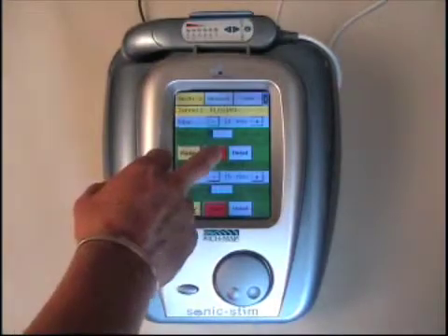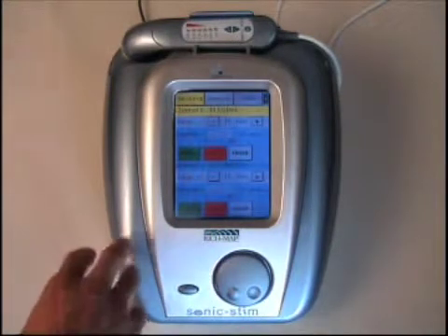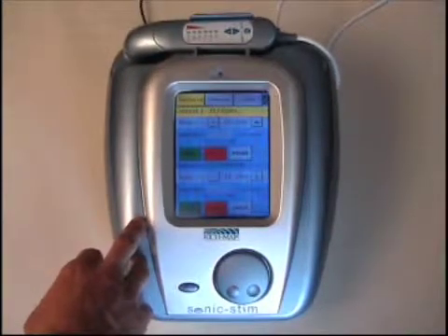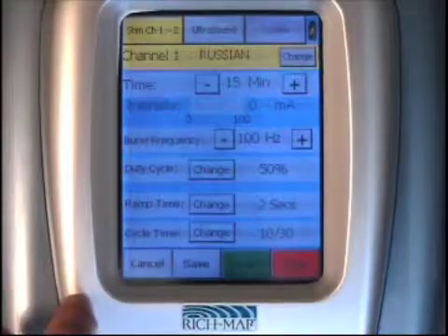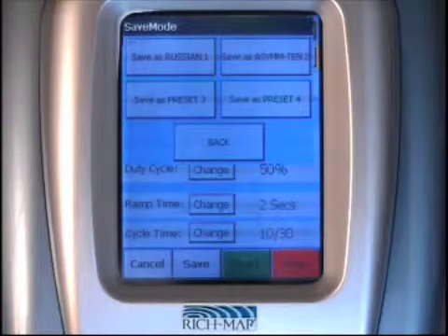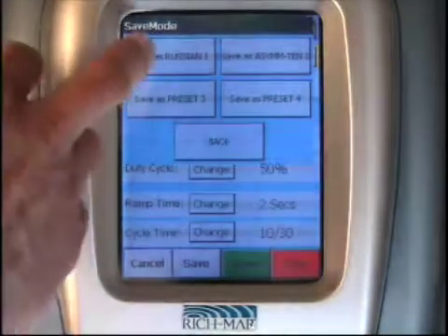Once the treatments are done, they either time out, pause, or stop. If you have a parameter you would like to save into the preset menu, it's very simple. Once you have run the treatment, you select the detail button and hit save. Once you hit save, you will get four presets. The four presets can be saved as new or you can override any treatment you've saved in the past.